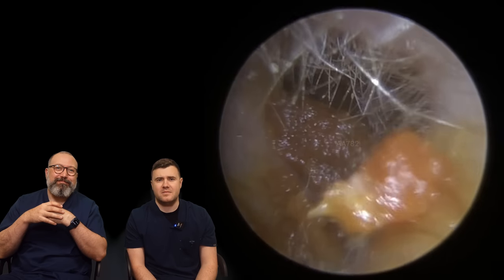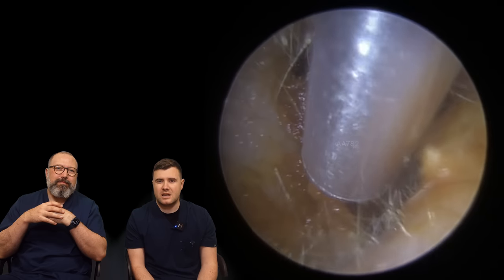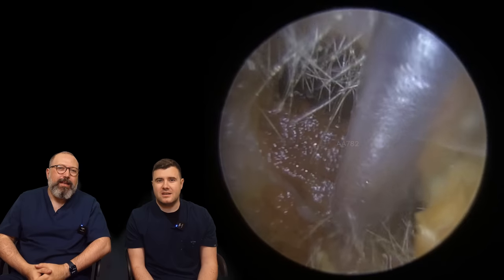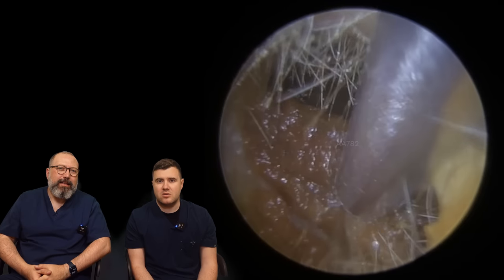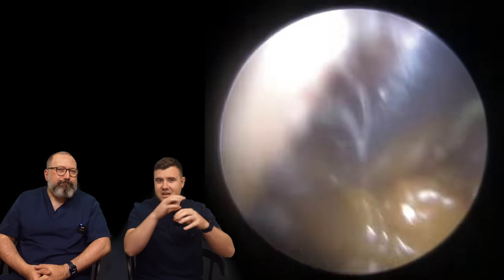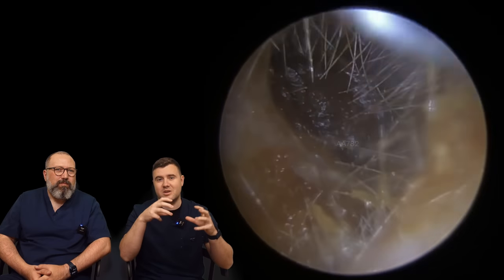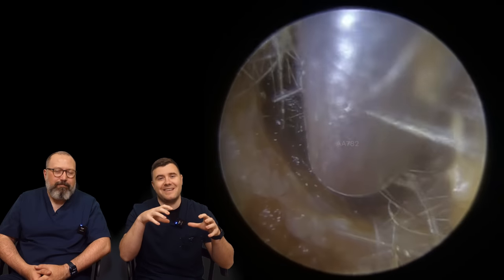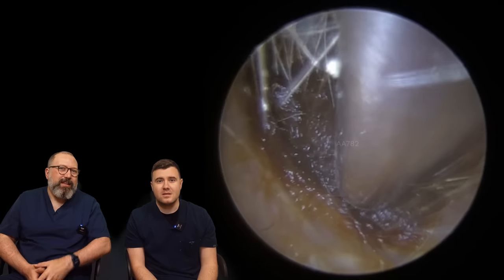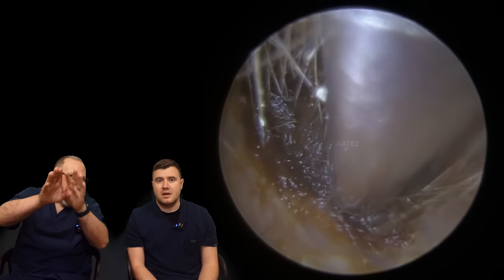Very, very similar on this side — it almost looks a bit more soft, like it's going to be quite squishy. We've got the standard size on the tube. A lot of the time when you see this kind of sheen on the front surface of the wax, it could be one of two things: it could be very, very wet, sticky and runny, or it could be absolutely rock solid — there's no in between. Now that's going to be more difficult to remove, because it looks impacted down in there. You can see it sloping down onto the canal wall surface all the way around.